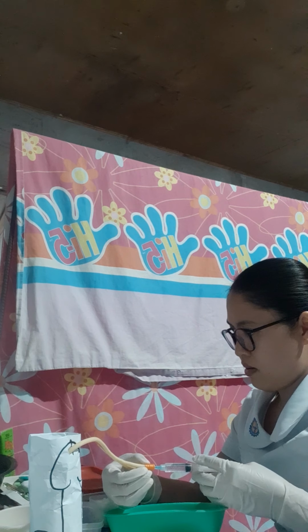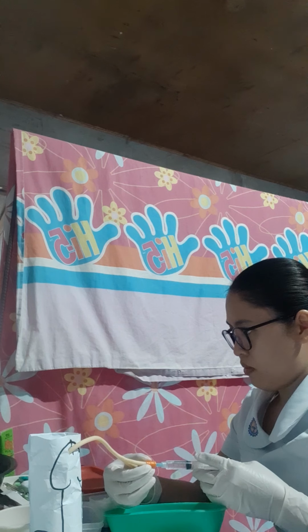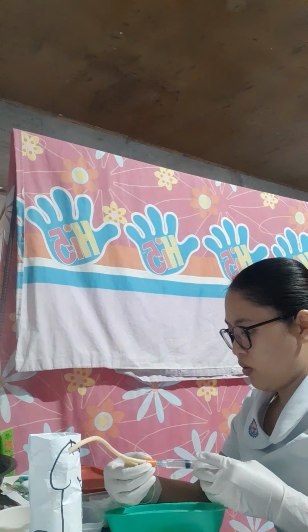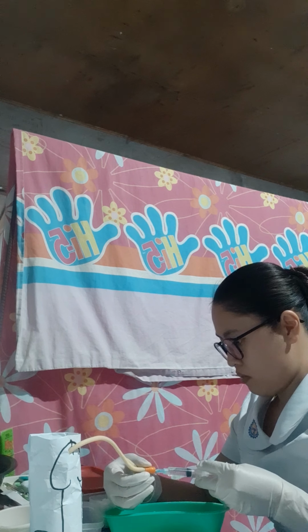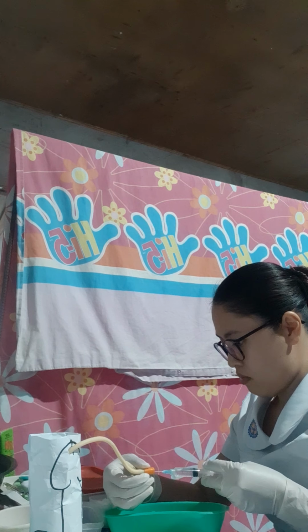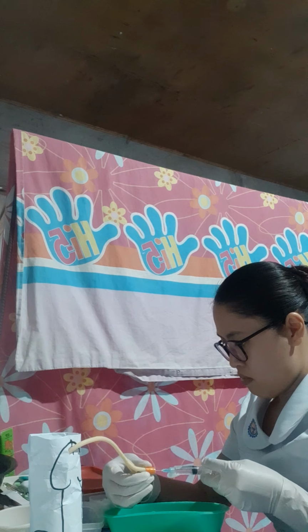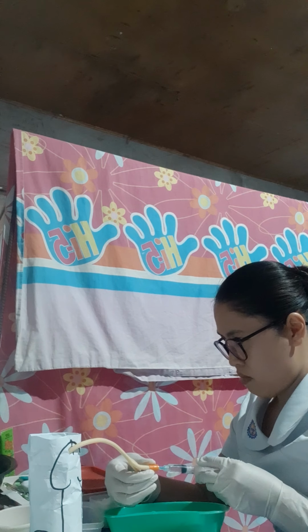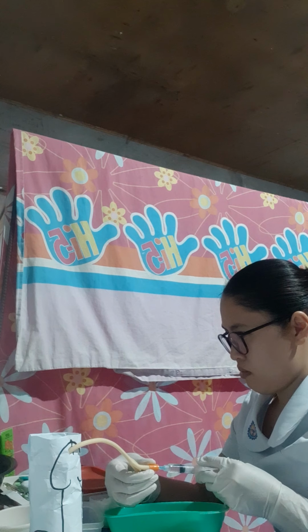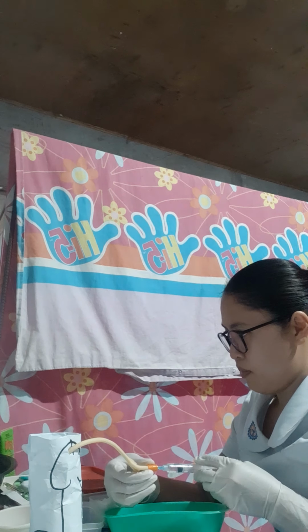Then inject the solution into the port at the end of the catheter.